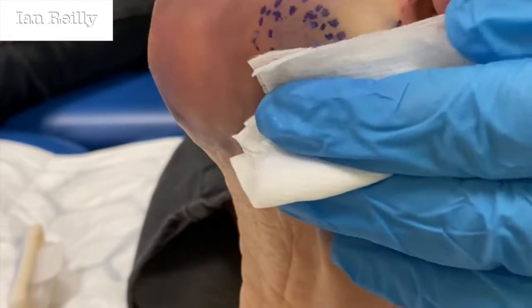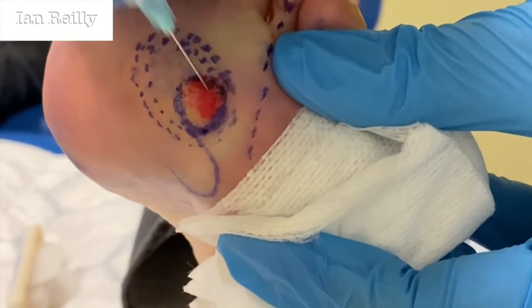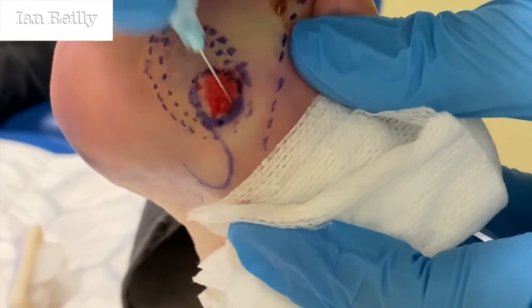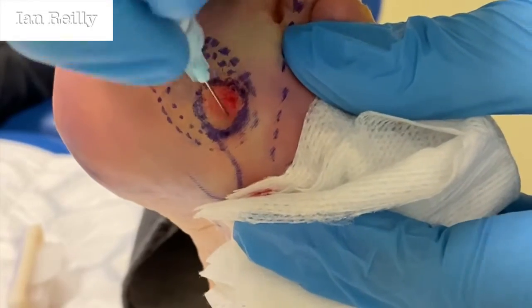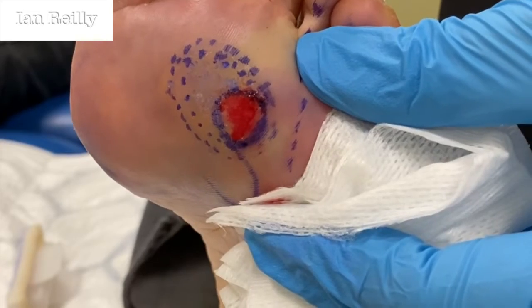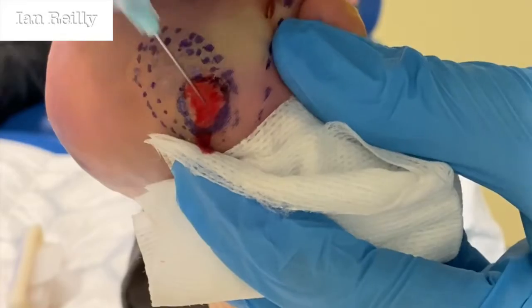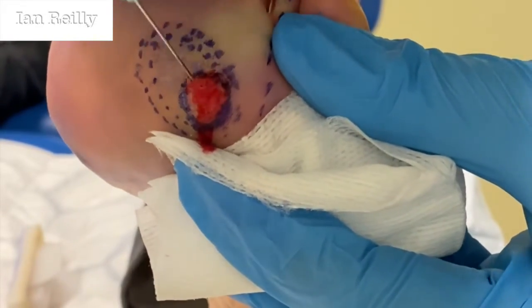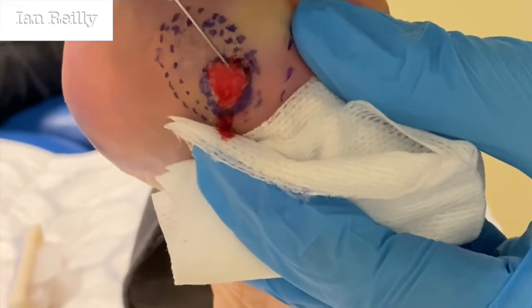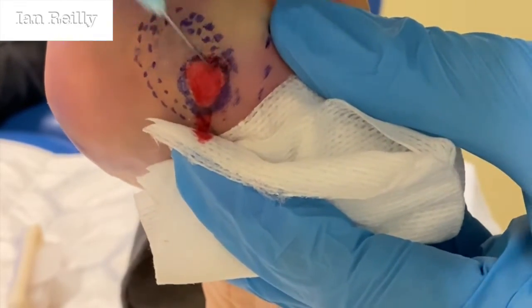We want to do lots of little passes — this is where it'll be a little bit sore afterwards. With needling I'm trying to release as many virus particles as possible — kind of like 'release the balls' — and then push them below the skin so the body can go, 'oh, you've got a veruca, I'll sort that.' Because at the moment the body is blissfully unaware that the veruca is there.